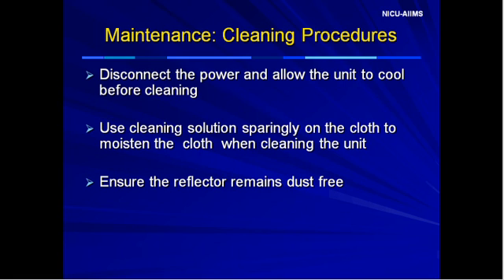The reflector inside the unit must remain dust-free. The company person should be contacted if cleaning of the reflector is not feasible by the user.